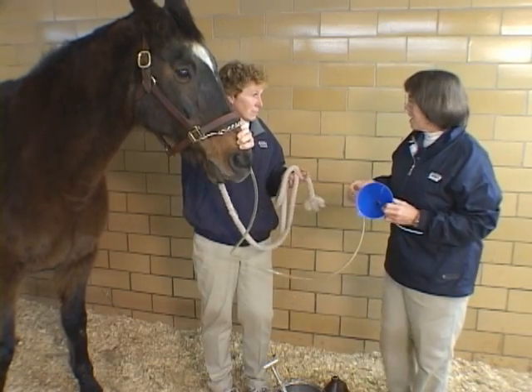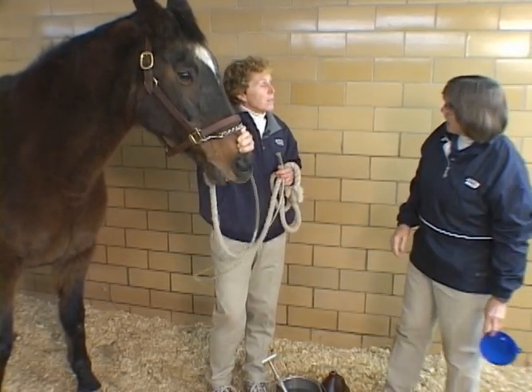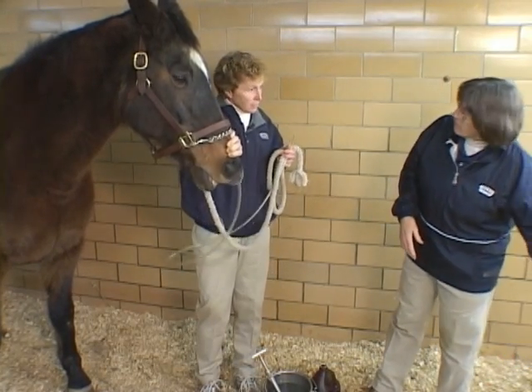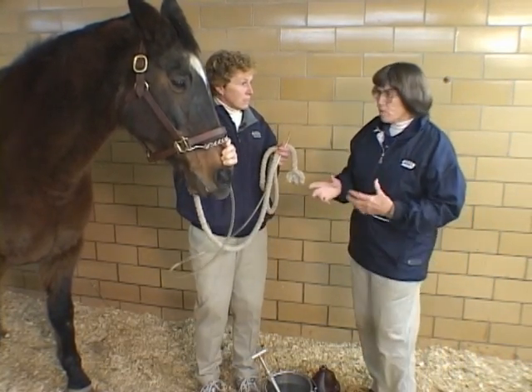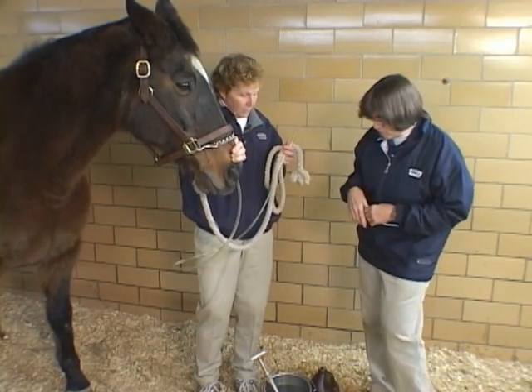I don't do gravity flow that much anymore. The exception would be when I'm giving colostrum to a newborn foal — I do that with gravity flow. If you really want to fine-tune how the fluid is running in, you would use gravity flow.